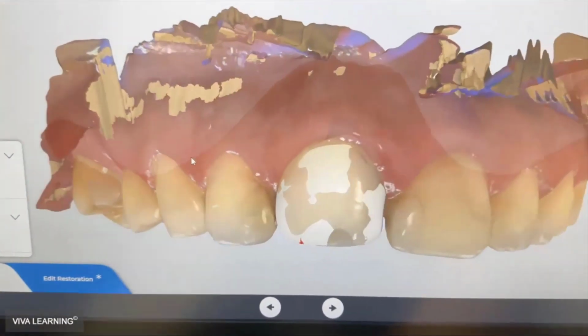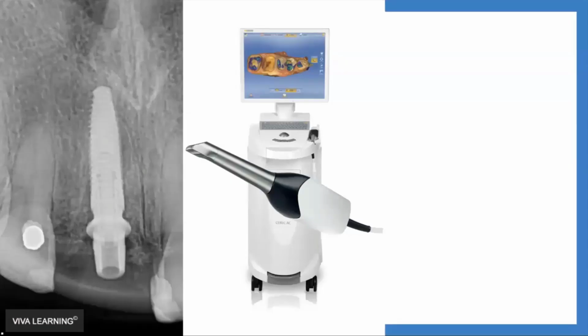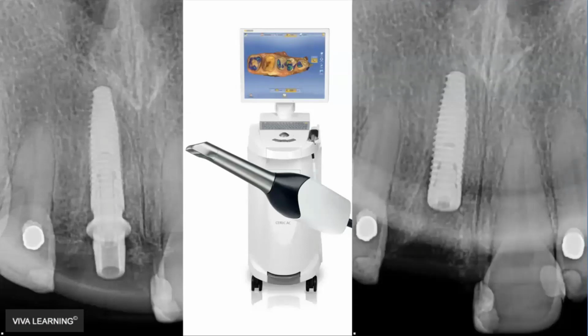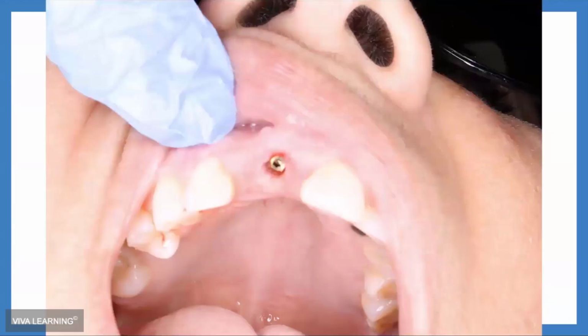And you will see if your implant is at the right depth, or if specifically in this situation, I like the depth of my implant on this one, but I was in between tie base sizes. So I almost went a little bit smaller with my tie base, but in general, I think what I have was doable, and I went with it. So then I put my cover screw on in this situation, and I just buried the implant and made her an Essex retainer. So she's been wearing an Essex retainer for the last 3 months, and maybe we're a little bit overzealous with that kind of pontic space, but it's fine.